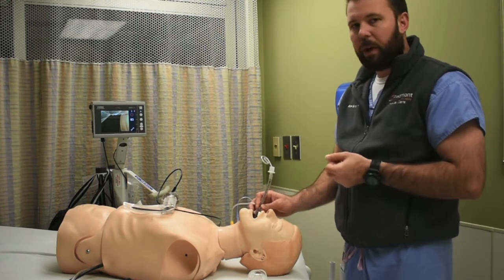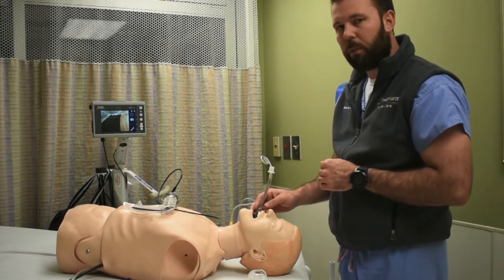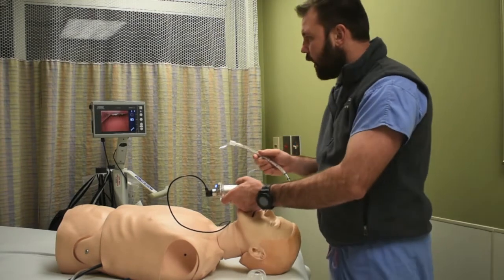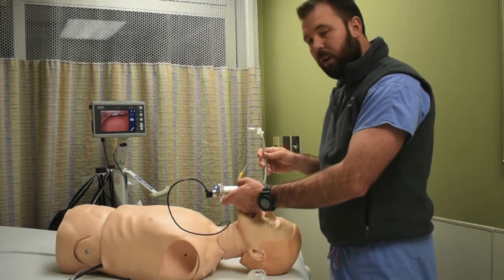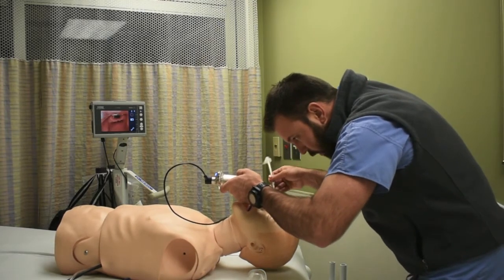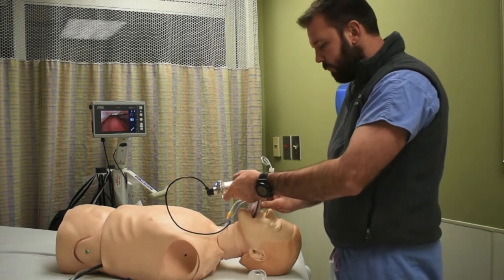Now, a couple things you may have noticed there is that we don't need to sweep the tongue out of the way with a video laryngoscope method. And another pointer here is that in the event that our screen becomes clogged with debris, we actually, with a MAC 3 or Macintosh 4 blade here, can transition to a direct view and just use direct laryngoscopy to intubate the patient.